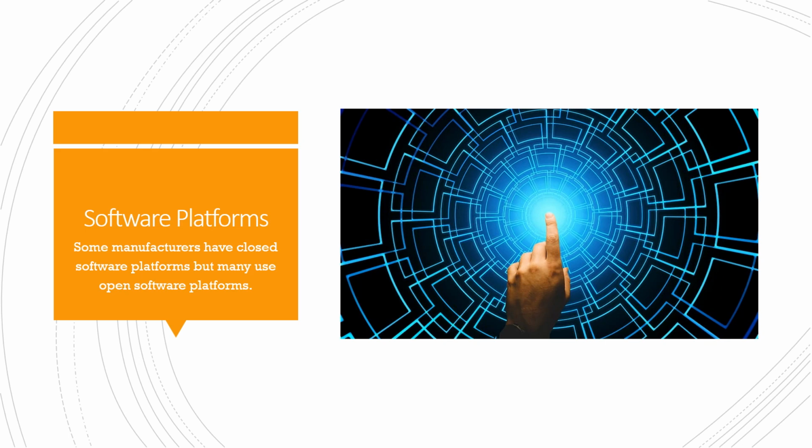But many are starting to use open software platforms, which allow images to be transferred and emailed on platforms produced by different manufacturers. This is a good thing because you don't know what the dental labs are using or what they can accept. So if you have an open platform, it allows you the ability to do more with it versus a closed platform.